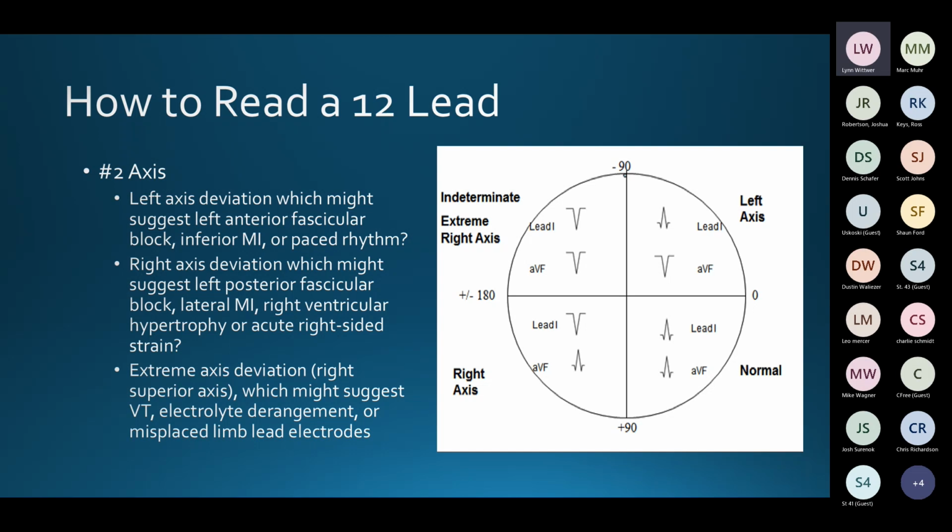It's because the left heart, the left ventricle, is stimulated after the right ventricle, because we place the leads for the pacemaker inside the right ventricle.